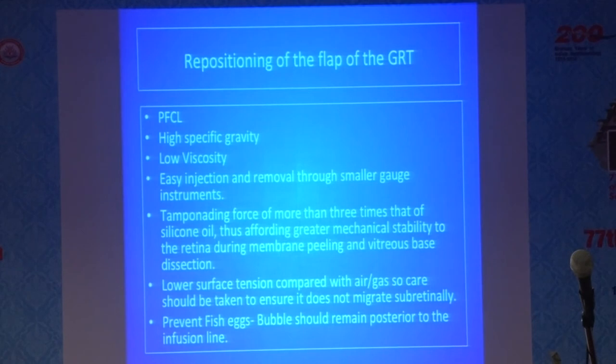It is a high specific gravity liquid, lower viscosity that allows easy injection and removal through smaller gauge instruments. The tamponading force of PFCL is more than three times that of silicone oil, thus affording greater mechanical stability to the retina during membrane peeling and vitreous base dissection.